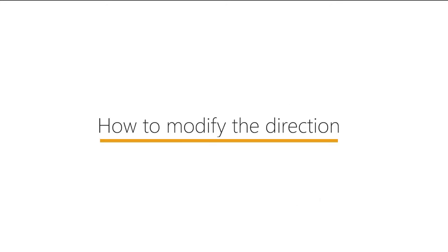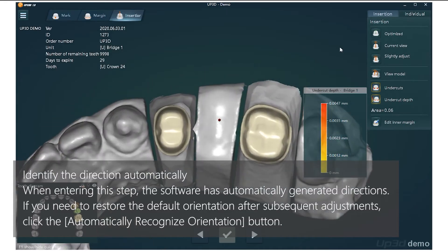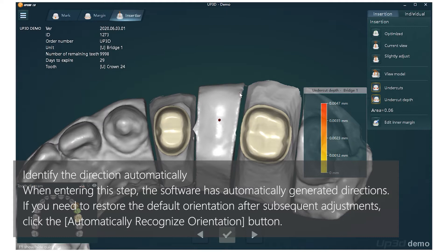How to modify the direction? The software can identify the direction automatically. When entering this step, the software has automatically generated directions. If you need to restore the default orientation after subsequent adjustment, click the Automatically Recognize Orientation button.